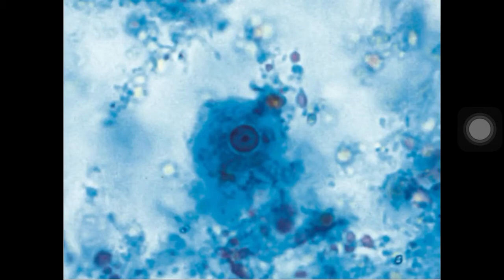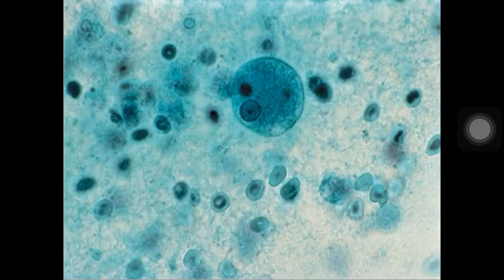Likewise, we can also see here the typical central karyosome and even peripheral chromatin. And additionally, we can see here the E. histolytica trophozoite with a centrally located karyosome, evenly distributed peripheral chromatin, and presence of ingested red blood cells as well.